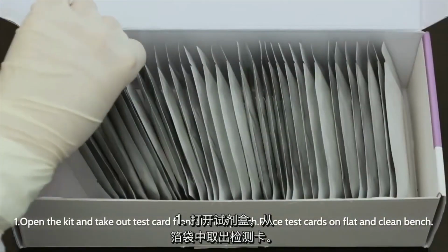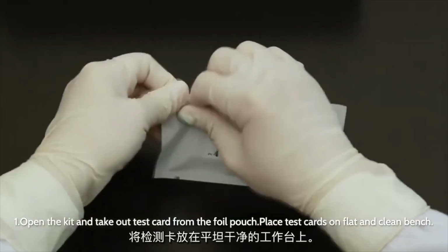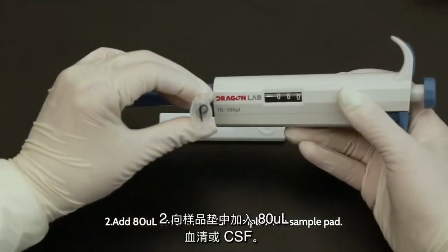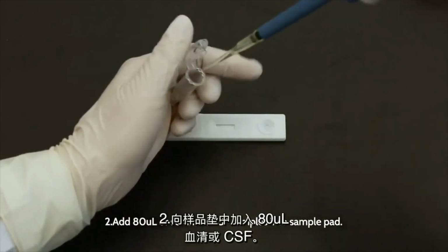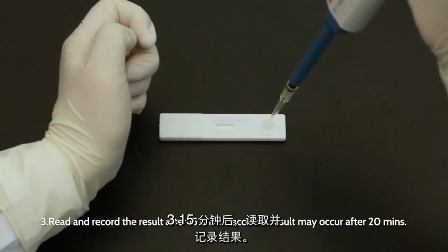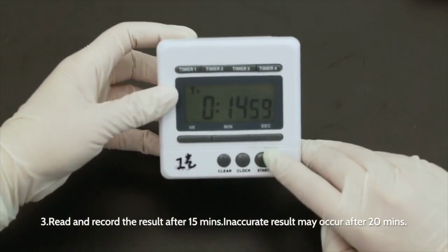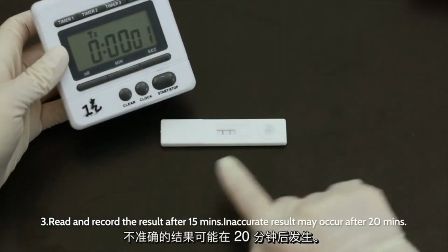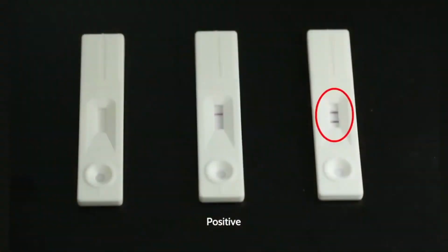1. Open the kit and take out the test card from the foil pouch. Place the test card on a flat and clean bench. 2. Add 80 microliters of serum or CSF sample onto the sample pad. 3. Read and record the result after 15 minutes. Inaccurate results may occur after 20 minutes. Interpretation of results: positive, negative, invalid.